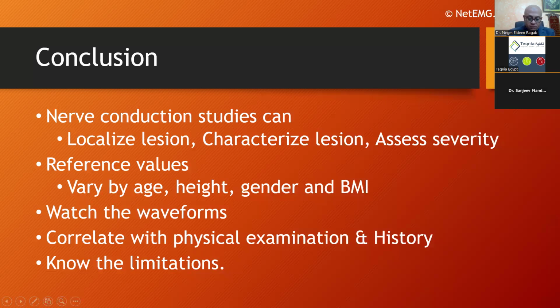Okay. The F wave latencies should be assessed in relation to the height. Because as I indicated, when we stimulate at the wrist, the action potentials will go to the spinal cord and come back. And that distance is going to be longer in people who are tall versus people who are short. So the F wave latencies will be dependent on each subject. So there are two strategies of assessing F waves. One is to define your normal limits based upon height. So you can have nomographs.